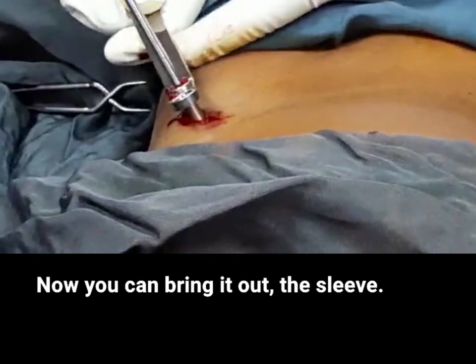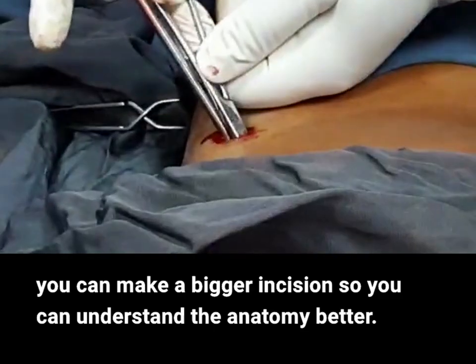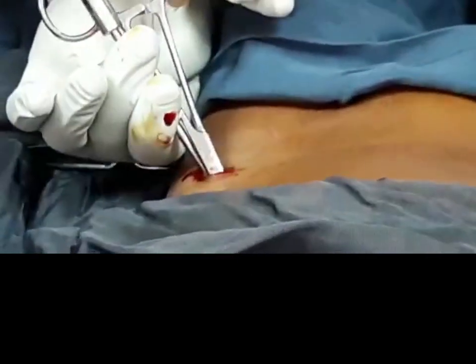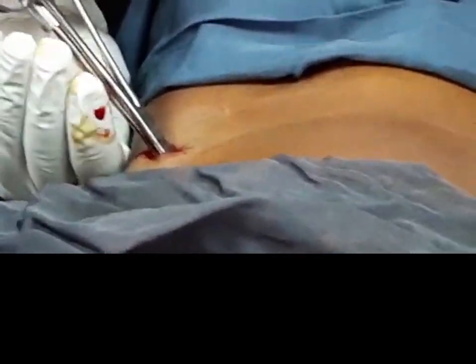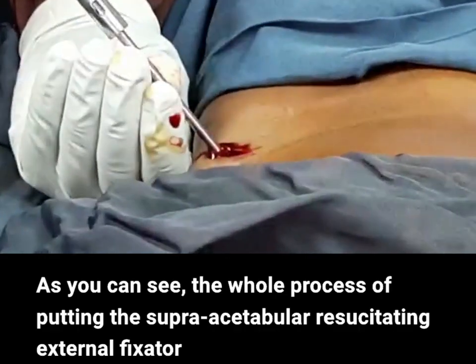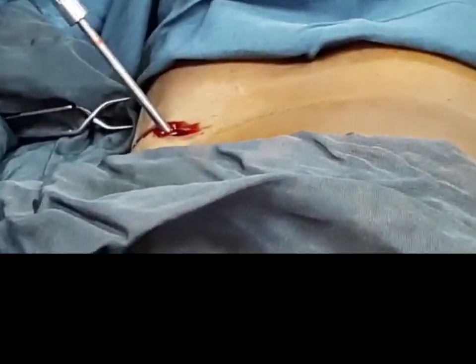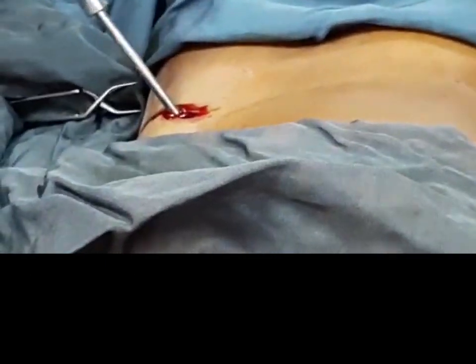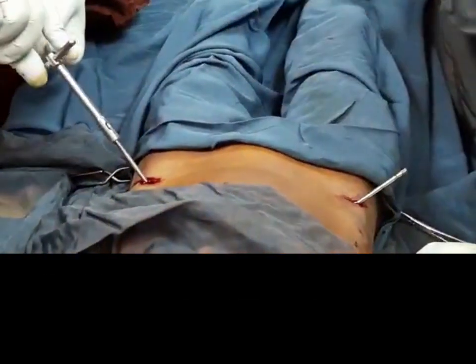Now you can bring it out. When you get started initially, you can make a bigger incision to understand the anatomy better, but once you are used to the anatomy you can make it smaller. The whole process of putting supra-acetabular pelvic external fixation should not take more than 10 minutes. Depending on how long we want the pin to be, we can put two bars or one longer bar. We need four clamps for this.